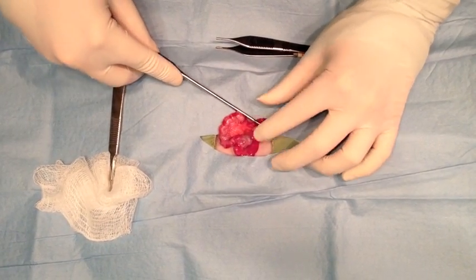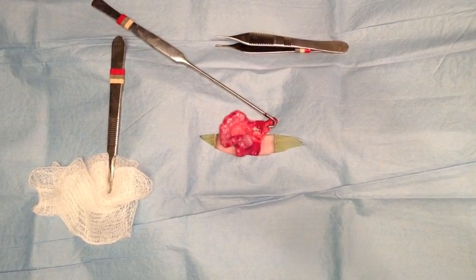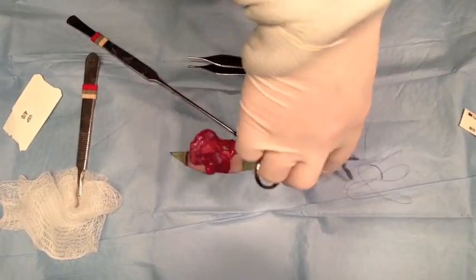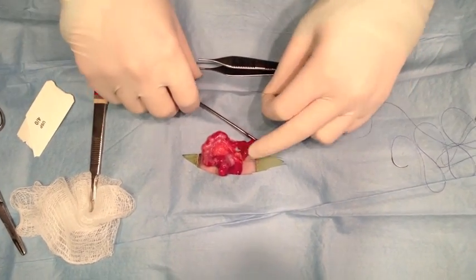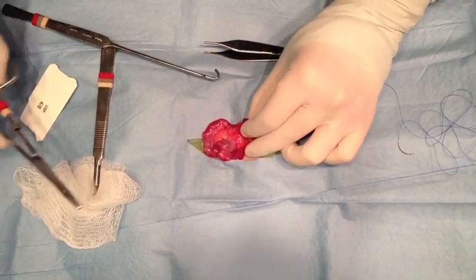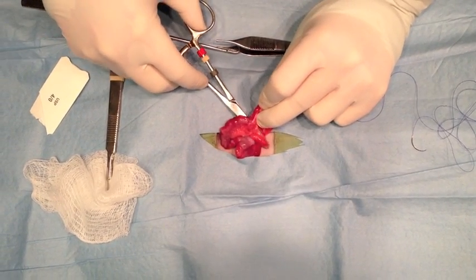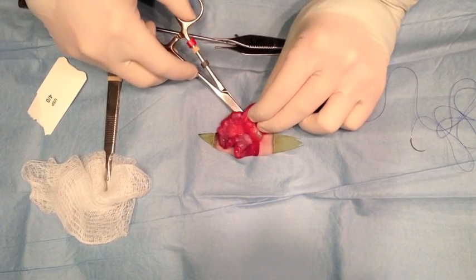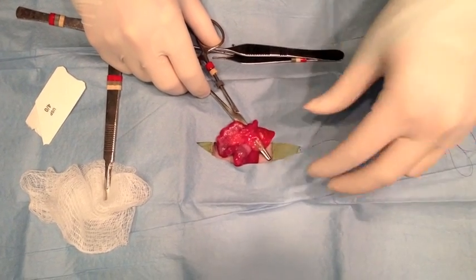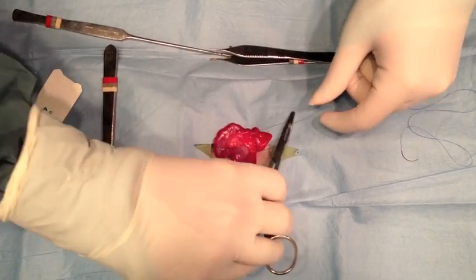That little white thing you see there is the ovary. I'm not going to do any major clamping because it's easy to tear everything. I don't clamp anything — I just make a little hole and proceed to tie a ligature, using the spay hook to keep the ovary out of the incision so it doesn't fly back into the abdomen. Here I'm going to make a little window in the broad ligament to bring my suture through and make a ligature around the ovarian vessels. This is where it gets a little tricky because you don't have a clamp holding everything out.